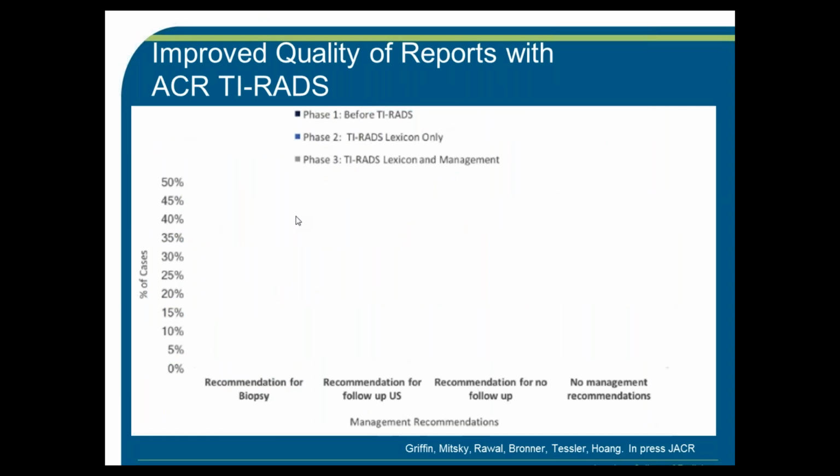It was a study that was performed with private practice radiologists at Radiology Partners. And shout out to Radiology Partners there. This is a study that was performed in 3 phases. In phase 1, we simply used free text of their reports. In phase 2, 7 of these private practice radiologists were asked to use the TI-RADS lexicon, so just describing the 5 features. And then in phase 3, this was when the TI-RADS paper was published, and the radiologists were then given the structured reporting template again with the TI-RADS risk category and the management recommendations.